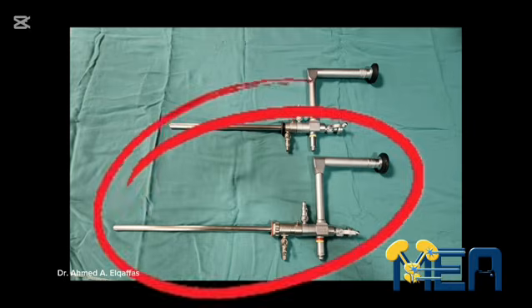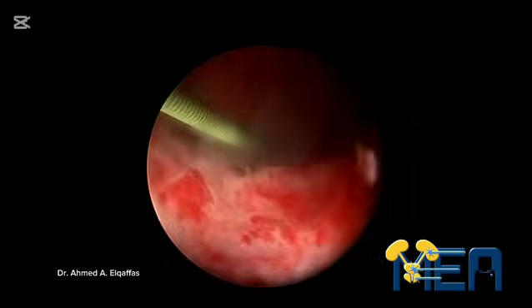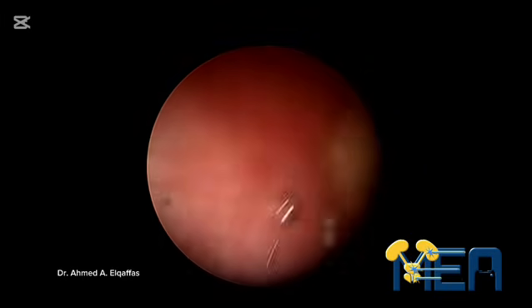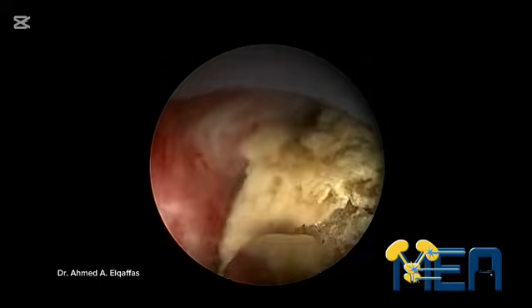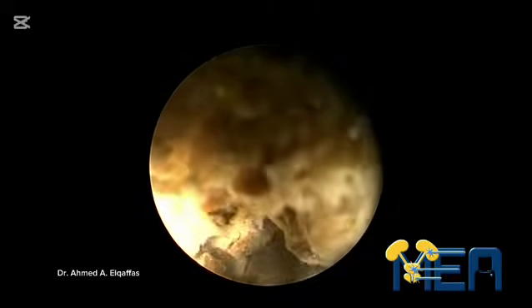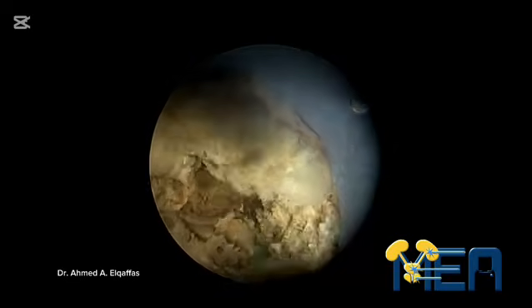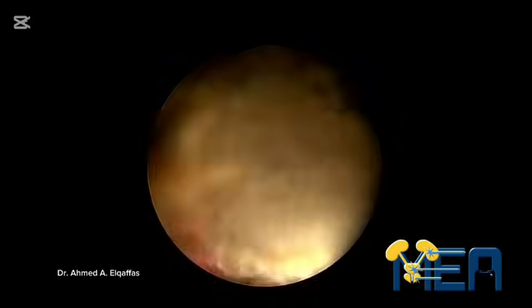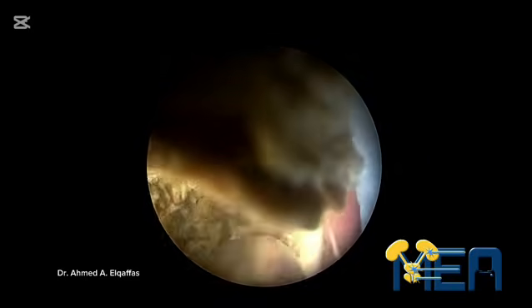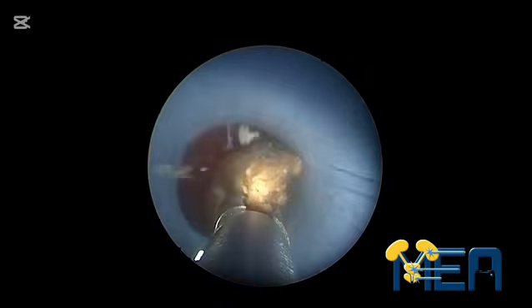Ensure that the long instruments and long nephroscope are available. Notice the long tract from the upper calyx to the stone in the renal pelvis. The stone looks soft and friable. So, the main bulk of the stone is sucked out by ultrasound. Using the forceps to extract the stone fragments.